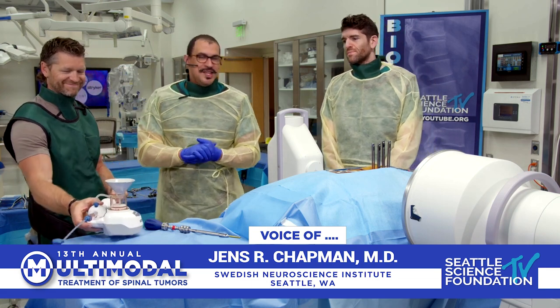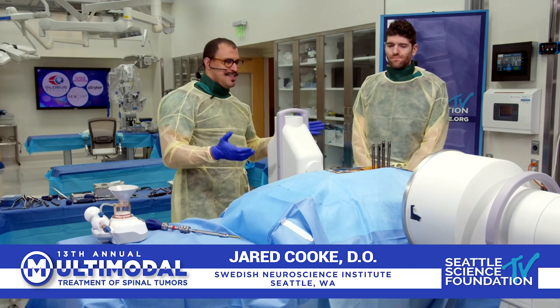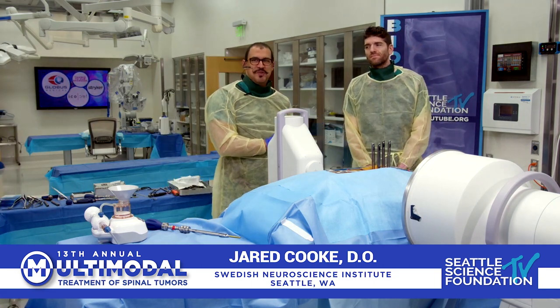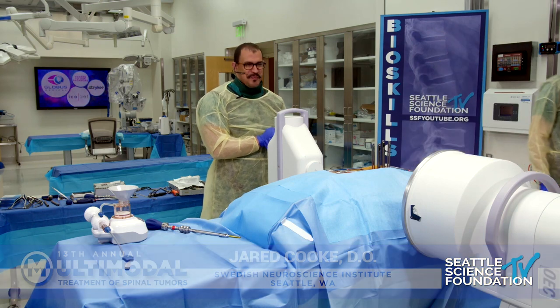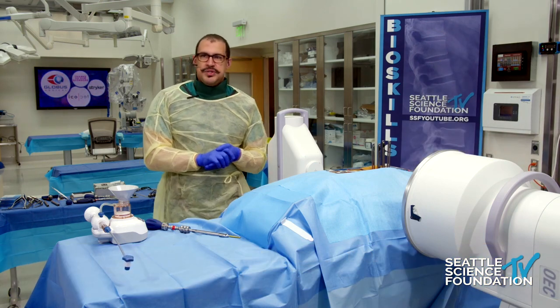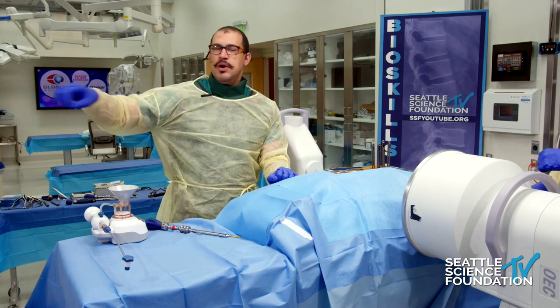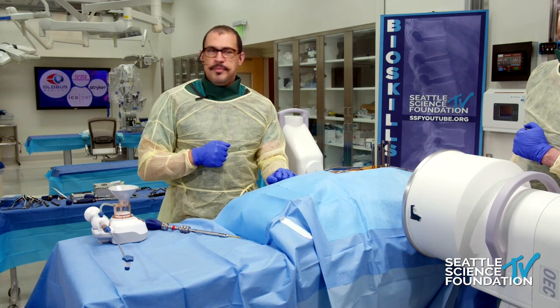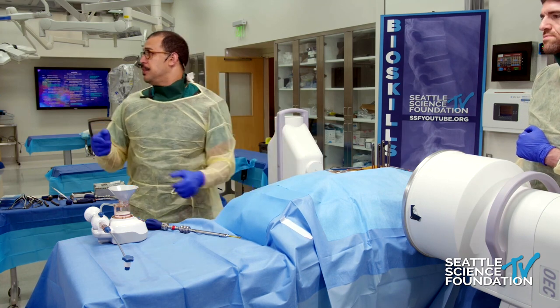That's impressive. Amir, we couldn't hear that — we didn't have a microphone on. So we've pre-instrumented the spine here. If you want to pop up one of our fluoro images, we can take a new shot. Go ahead and start mixing that cement.